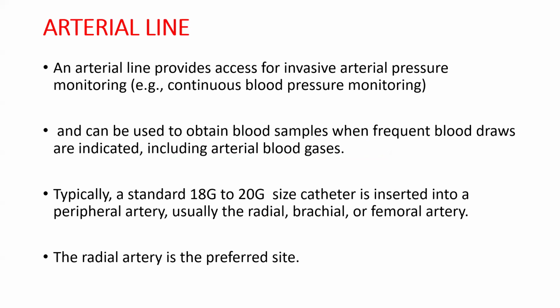So first is the art line. The arterial line provides the access for invasive arterial pressure monitoring. That is, continuous blood pressure monitoring will be possible with the help of the art line. It can be used to obtain blood samples whenever frequent blood draws are indicated, including ABGs.